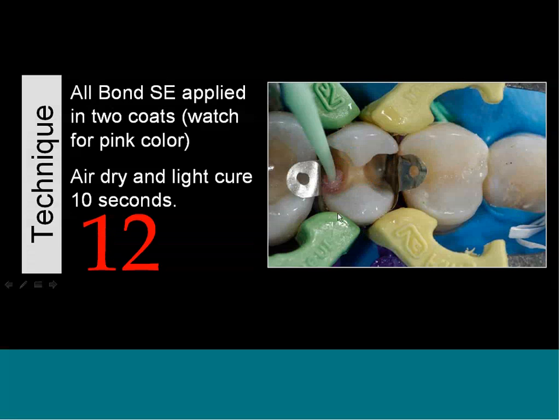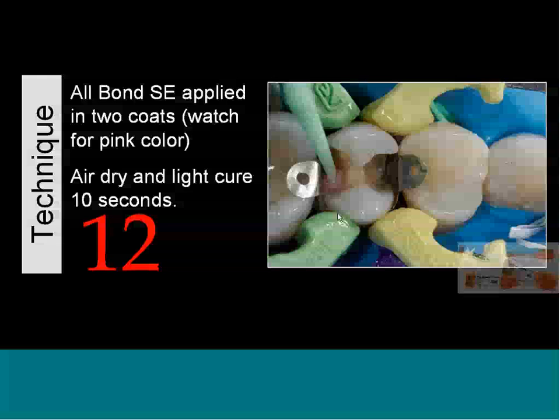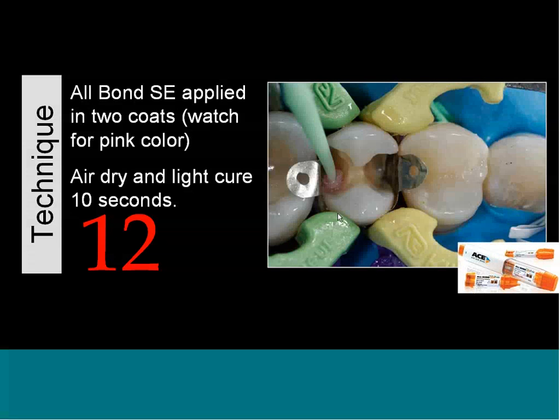And one of the nice things about this particular adhesive is it changes color, so it's really easy for the assistants to know they've mixed it properly and it's ready to use. So you want to look for the pink color. And it's also nice, my assistant Ursula loves it now because it comes in the ACE dispenser, makes her life a lot easier, which makes my life a lot easier. So you're gonna place that, you're gonna air dry it, and you're gonna light cure it for 10 seconds.